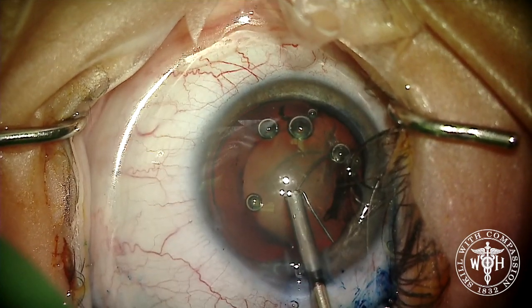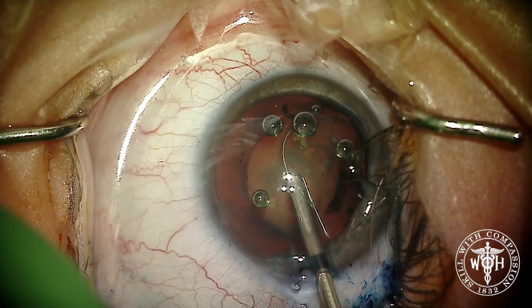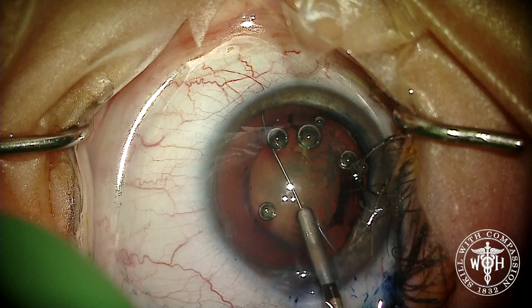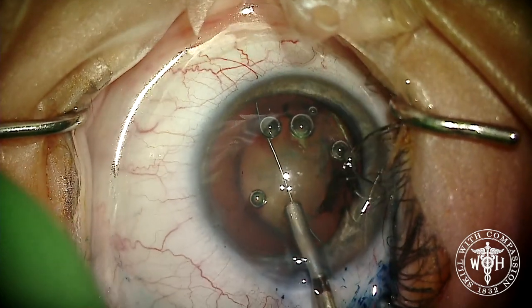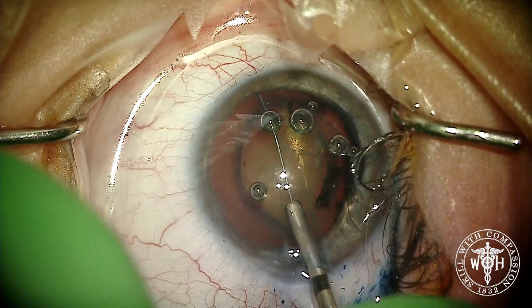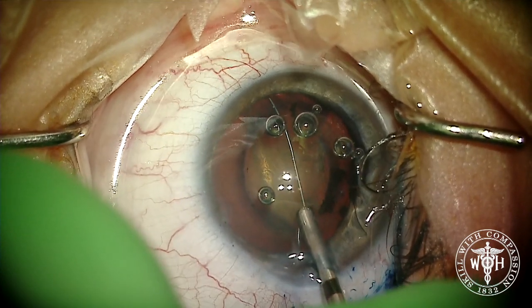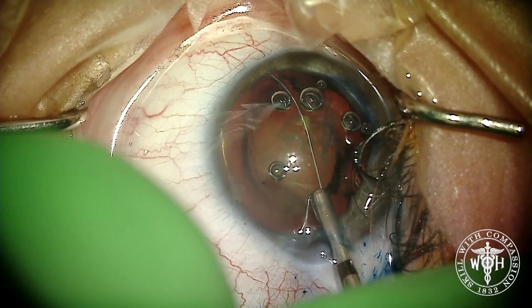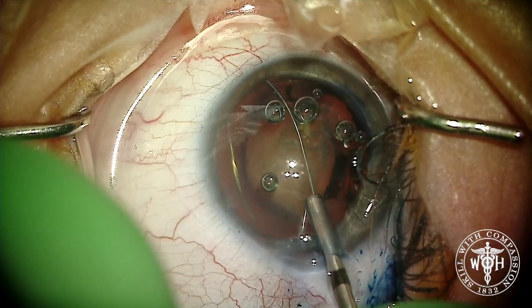The MyLoop device goes in the eye and you can see the nitinol loop start to surround the lens, making absolutely sure that you are in the capsular bag. Then we'll sweep that MyLoop device all the way across the lens and you can see it down below, crossing to the other side.